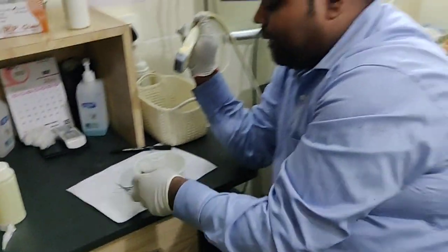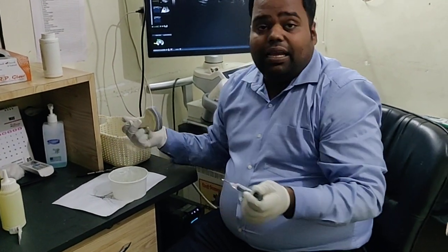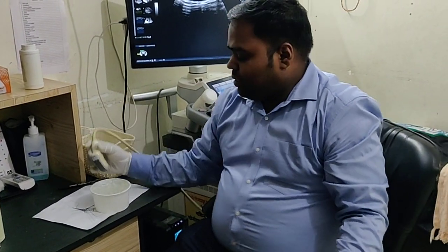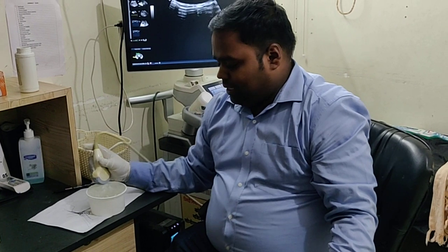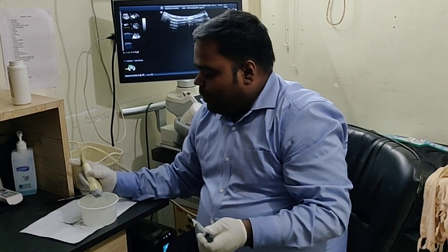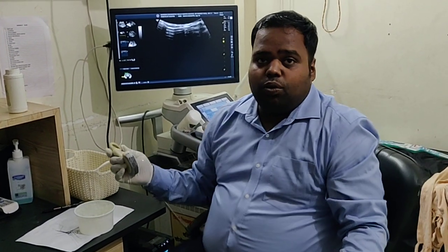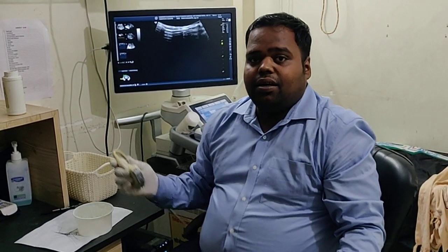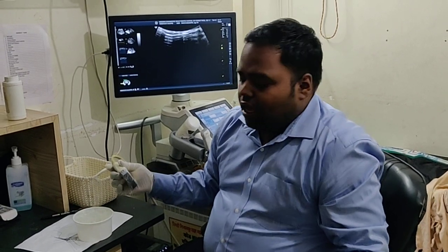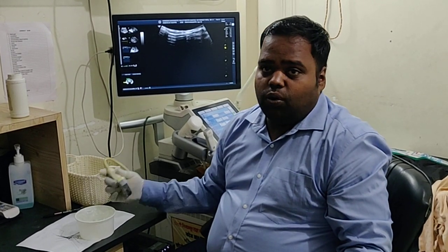We have a Logic P9 machine in my center. I used to practice on jelly in a bowl — you also practice it in the same way. Try to keep air bubbles in the jelly, and by practice you will get an orientation. It hardly needs half an hour and you will get a good orientation on how to put the needle.